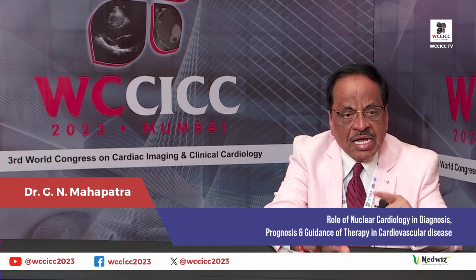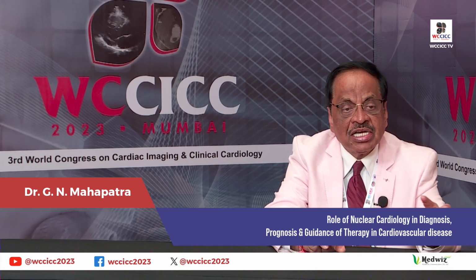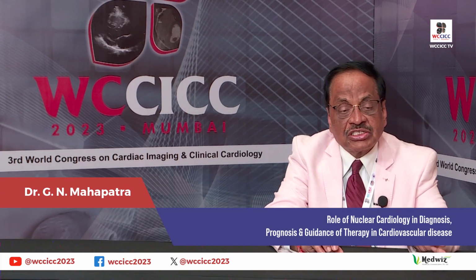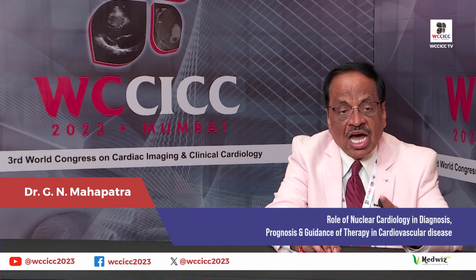If you find a mismatch, a perfusion defect with FDG uptake, that is called viable hibernating ischemic myocardium. If the perfusion scan shows abnormality and the viability scan also shows abnormality, that is called a match pattern. That is called infarcted scar, dead myocardium. This is the gold standard in the assessment of myocardial viability using F18 FDG.